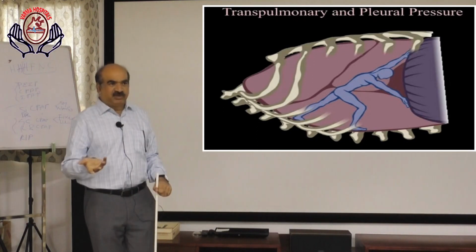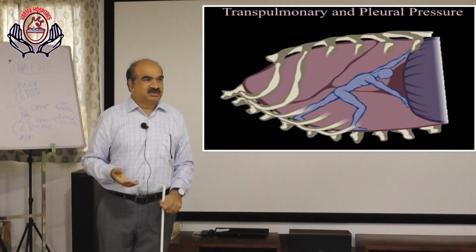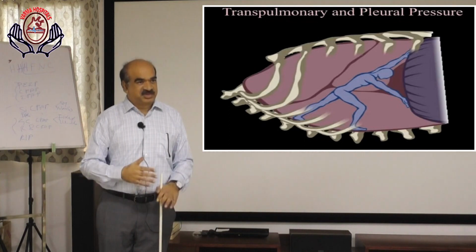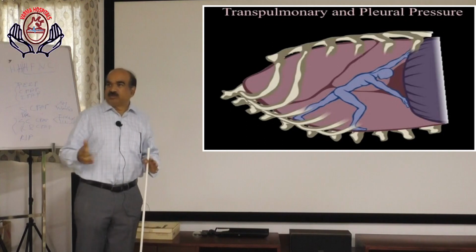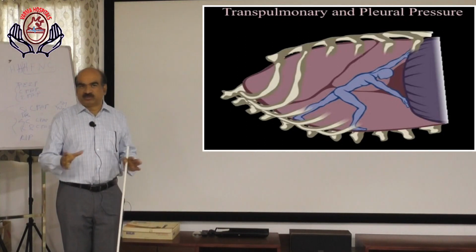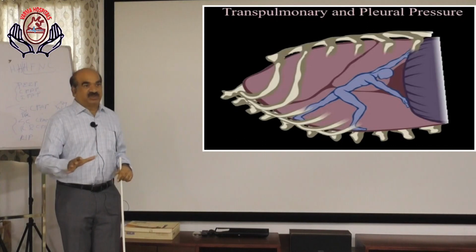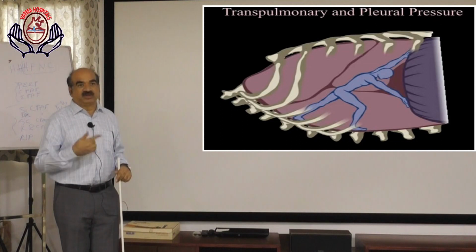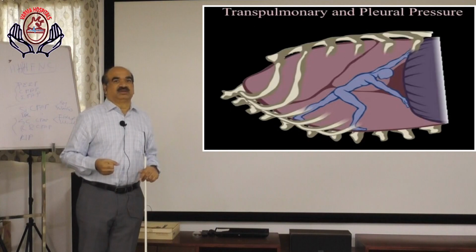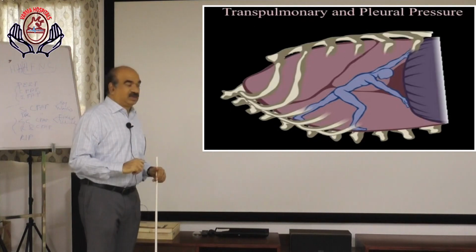Even for compliance, there is static compliance, dynamic compliance, total compliance of the lung, specific compliance of the lung, hysteresis part. So with information on all these factors, we can get almost full assessment in the ventilator graphics. So those graphics are very important. The continuous monitoring of these factors is very important. We should know the stress and strain the lung or chest wall is facing. We should know the mechanical power of the ventilator.